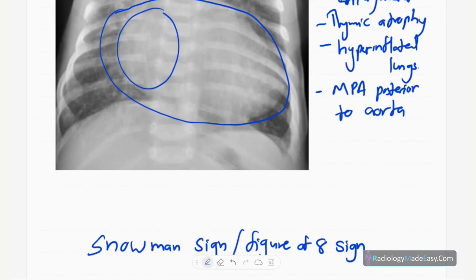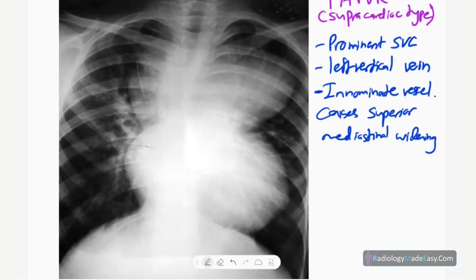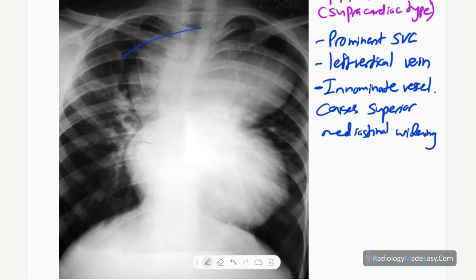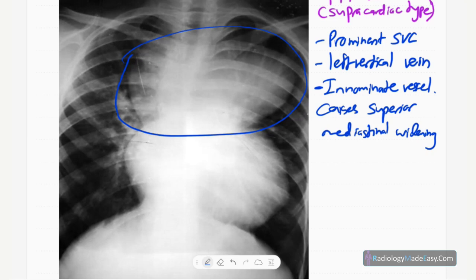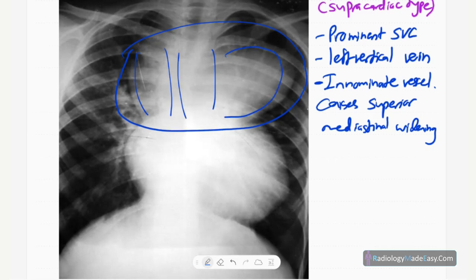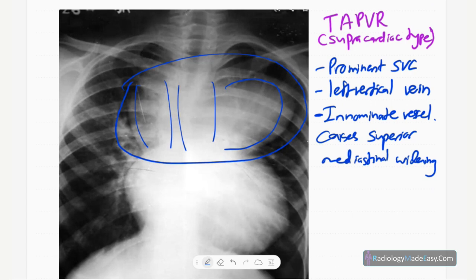The second sign is the snowman or figure-of-eight sign, seen in total anomalous pulmonary venous drainage (TAPVD), specifically the supracardiac type. There is widening of the superior mediastinum caused by a dilated SVC, the innominate vessel, and the left vertical vein. These three dilated vessels — prominent SVC, left vertical vein, and brachiocephalic vein — produce the figure-of-eight or snowman appearance.